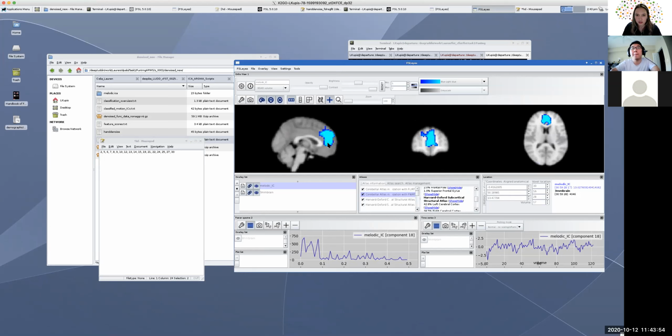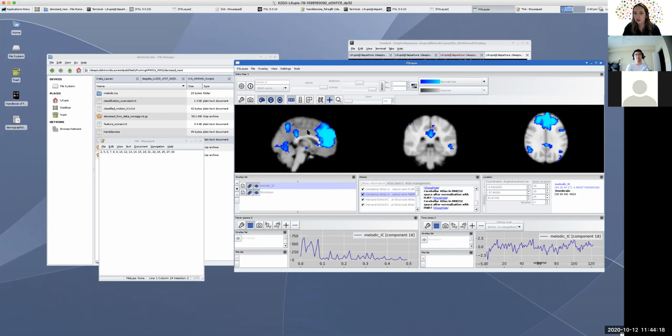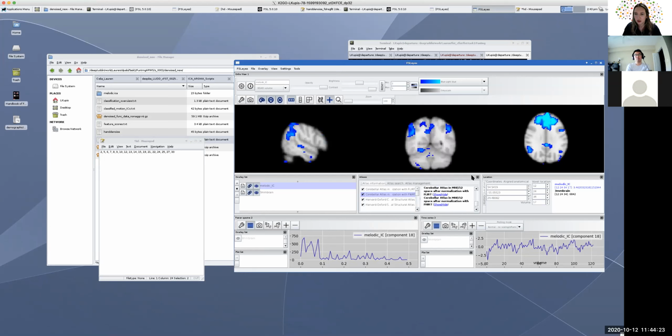Yeah, so when I zoomed in, this one was more on the cortex rather than white matter. Even though this isn't perfect, it does have some higher peaks in the power spectrum. Just by looking at it and seeing that it's mainly in the cerebral cortex, I would probably go ahead and keep that as signal, just to be safe, even if it is a little bit mixed with noise. So I would keep that one as signal.